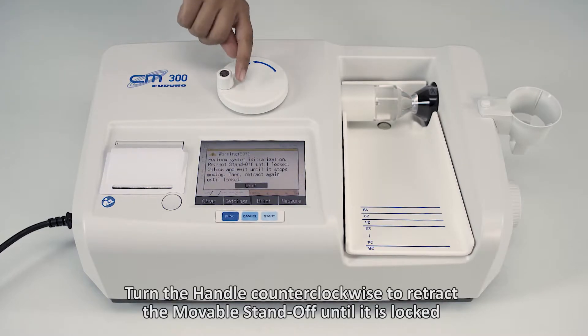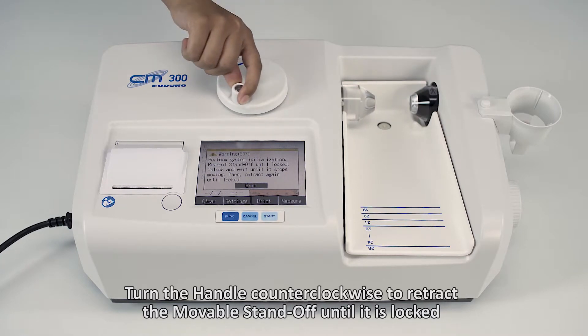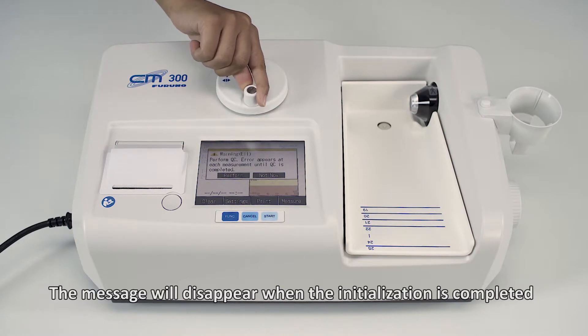Turn the handle counterclockwise to retract the movable standoff until it is locked. The message will disappear when the initialization is completed.